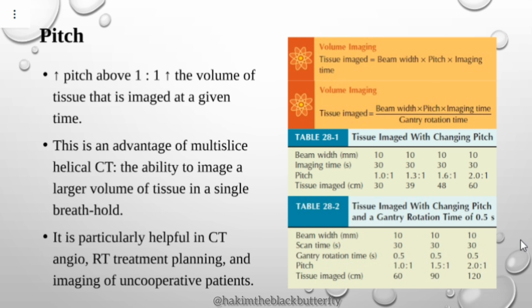So it is particularly helpful in CT angiography, a pitch of greater than 1. It is very helpful in CT angiography because you want to capture contrast when it is still in circulation at a very high speed.